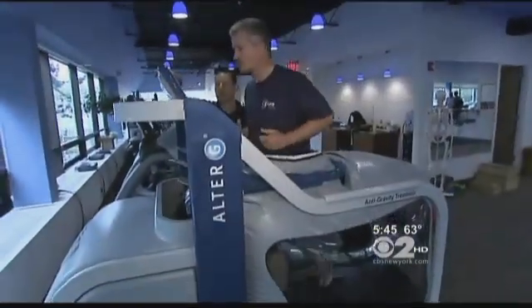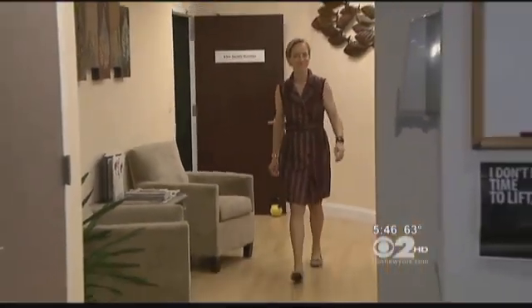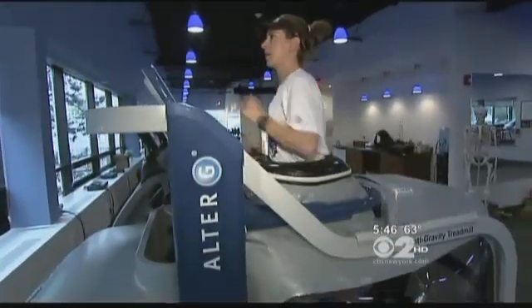But it's not just for astronauts and curious reporters. A patient following injury does not have the ability to walk normally. It takes the pressure off of that injured limb so that they can now learn to walk more normally. Claire Zicker is a triathlete who broke a bone in her foot during training. She said the Alter-G allowed her to keep training while she was rehabbing her injury, reducing the amount of weight on the treadmill so that she could run again with no pain.